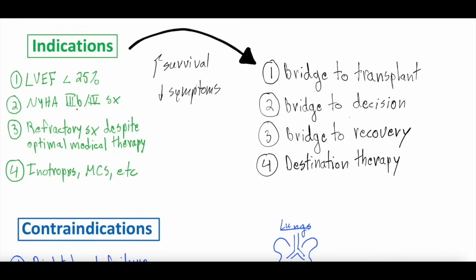Obviously, this is a significant surgery. These patients need really close monitoring at outpatient appointments. They need to be on special blood thinning medications and all that. So these are all subjective, but some rough guidance is the ejection fraction, how much the left ventricle can pump blood out. It's got to be very low, less than 25%. These are all dense details, and I'm going to skim over these briefly, but for those interested, we can do a deeper dive later on.